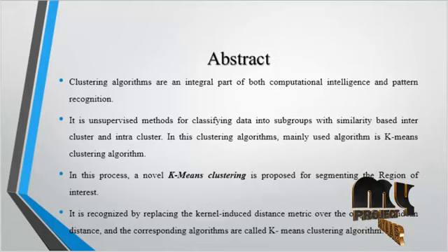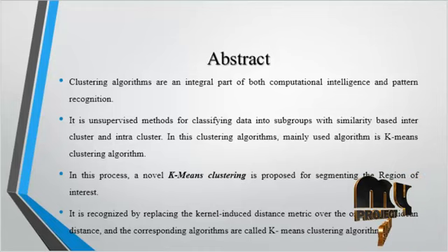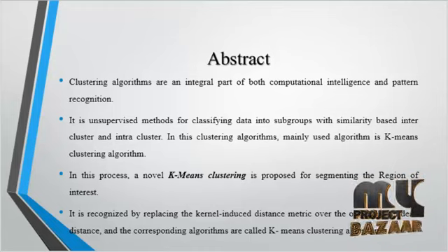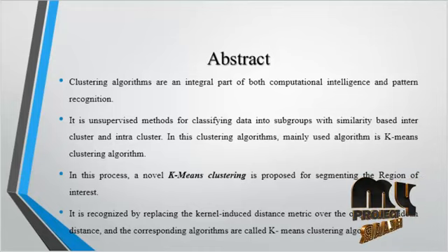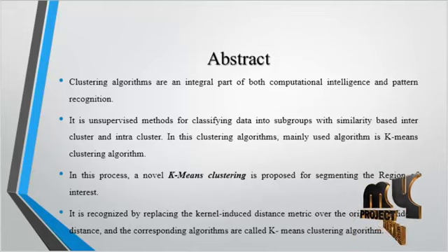Now we are going to discuss the abstract for the process. Clustering algorithms are an integral part of both computational intelligence and pattern recognition systems. It is an unsupervised as well as semi-supervised method for classifying data into subgroups with similarity-based inter-clustering and intra-clustering methods.